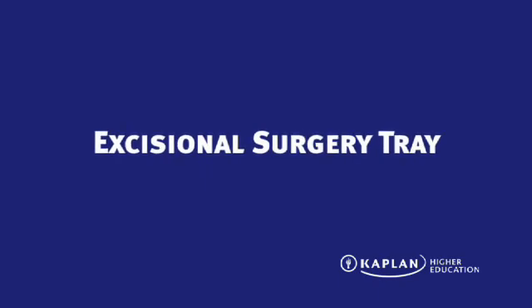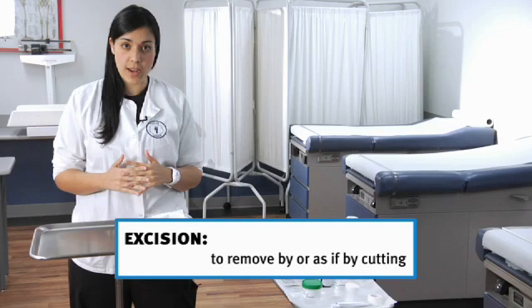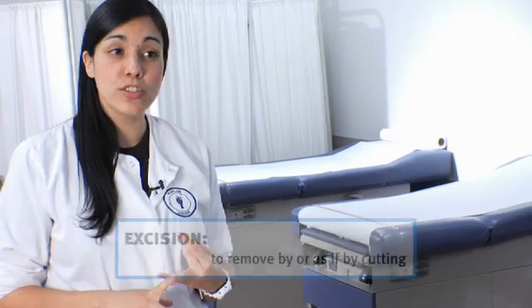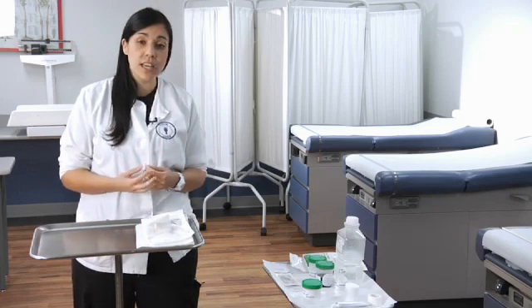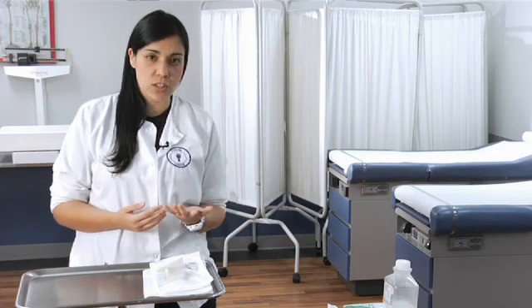The next tray I'm going to demonstrate is called the excisional surgical tray. This tray is mainly used in urgent care type settings, minor surgery, and sometimes even dermatology. The patient will possibly have a birthmark, mole, or cyst that needs to be removed and sent in for a biopsy to check for malignancies such as cancer.